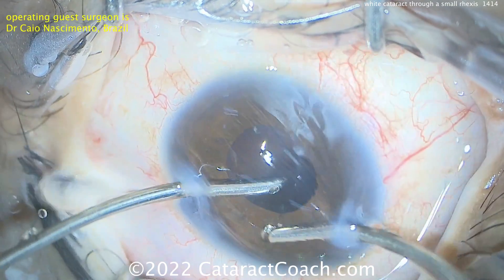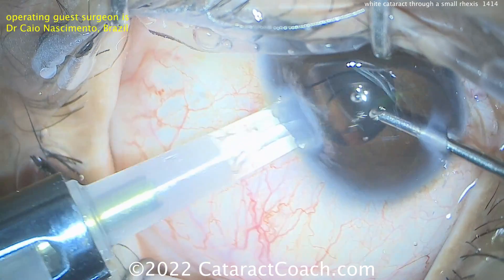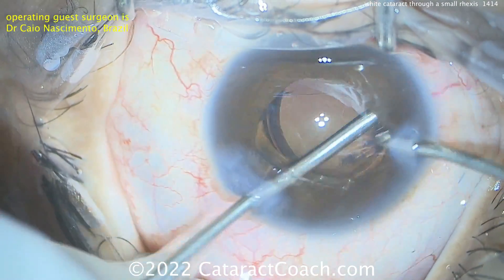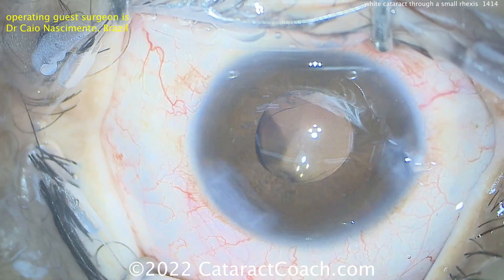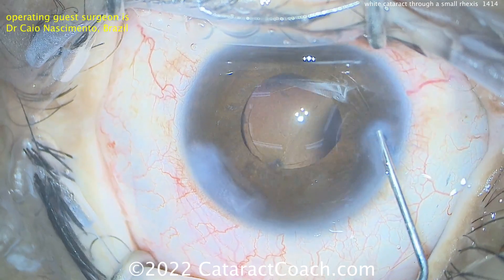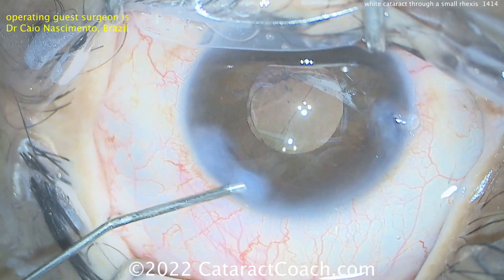It's interesting that the surgeon did it this way, and I think you're going to get a hydro implantation of the IOL next — and there it is. Fixating the eye, infusing the eye with the right hand, orienting the lens appropriately. You know the 7L rule — that lens is in correct position, looks great. Put it in the capsular bag. You can see that's definitely a small rhexis — about a 4mm capsulorhexis, maybe slightly smaller — in the setting of this eye with a 6mm optic. A little bit of wrinkling in the middle of the capsule, indicating some degree of zonular laxity. This case was expertly performed.